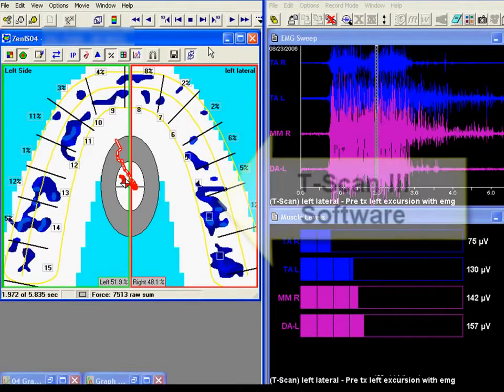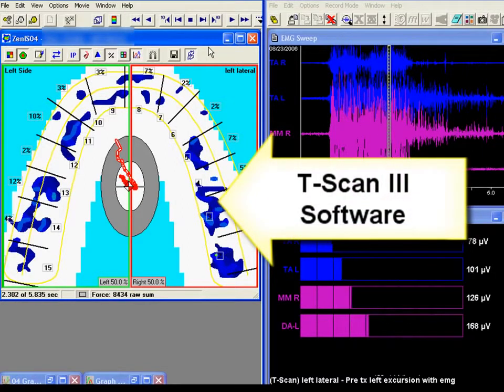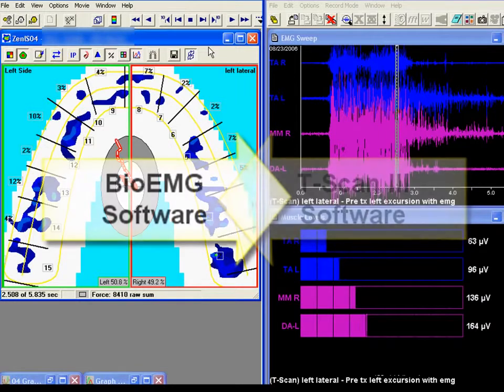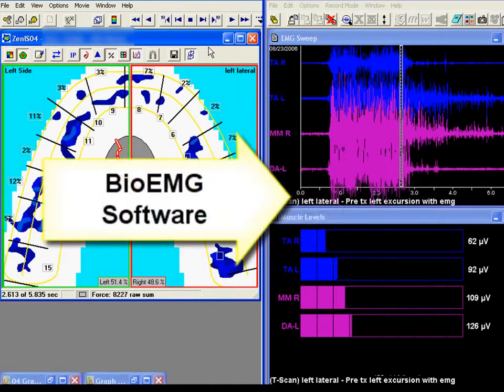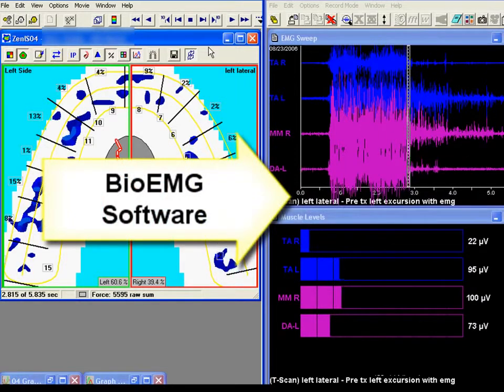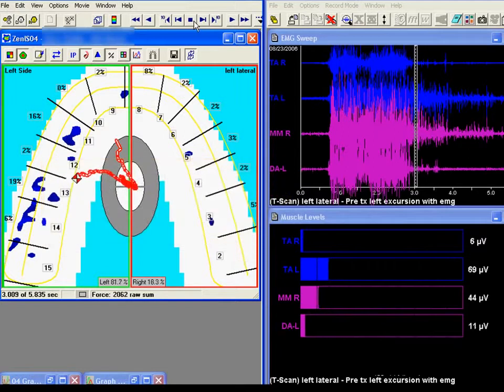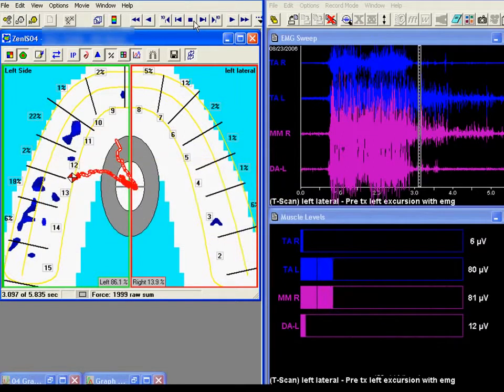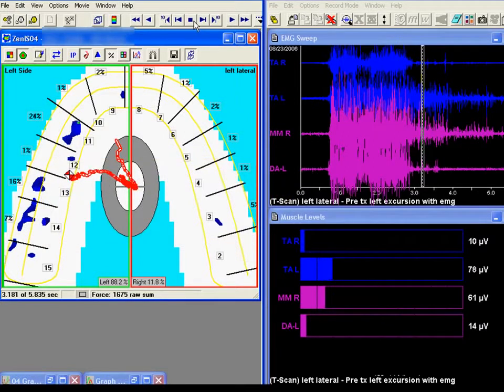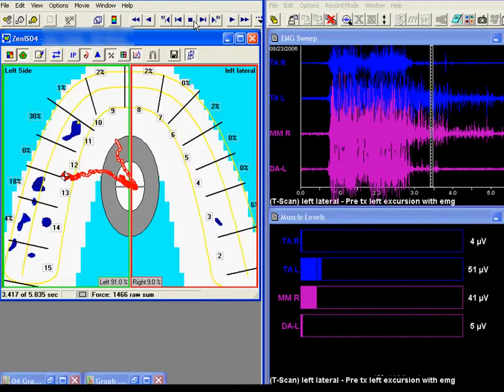In the next few slides, you will see an example of long disclusion time and the effect it has on muscle activity. This patient is Class 1 post-orthodontic and suffers myofascial pain dysfunction syndrome. We will also do a post-operative comparison to see how the patient improved after the clinical adjustments.